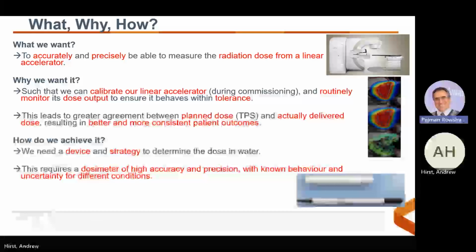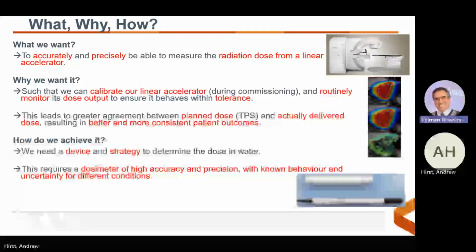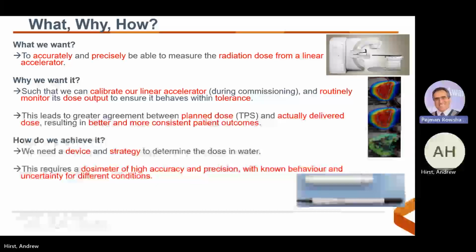So as you're going to see, performing any kind of dosimetry involves a lot of correction factors, conversion factors, and we need to accurately have a model of our dosimeter and of our medium in order to correct for the perturbations that the dosimeter causes in our medium.